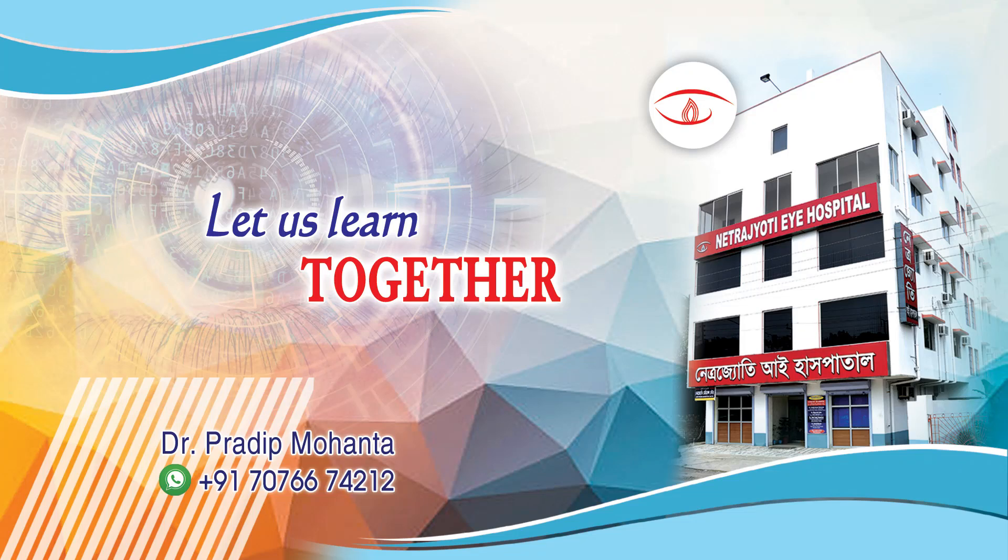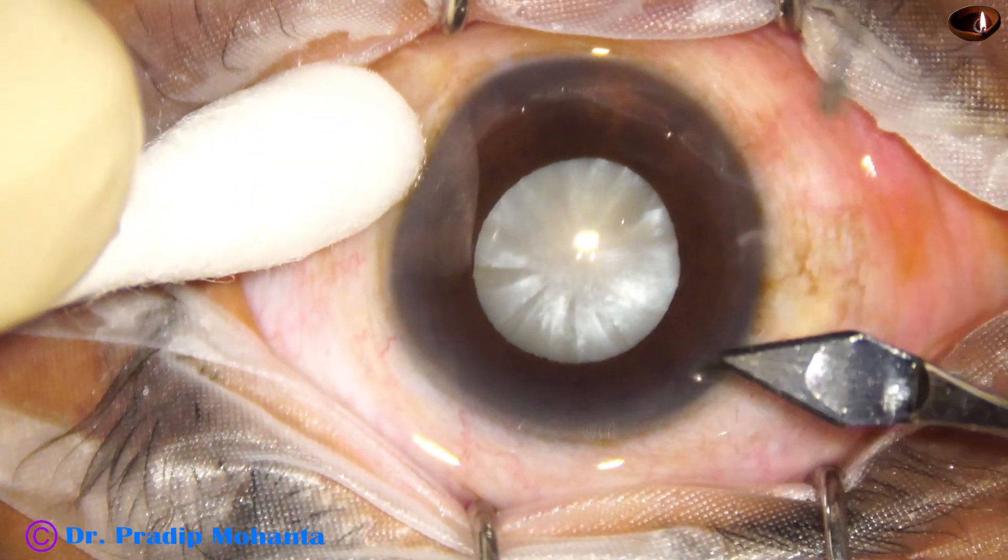Welcome to my workplace at Ranaghahat, West Bengal, India. Let us observe this totally unedited surgery.